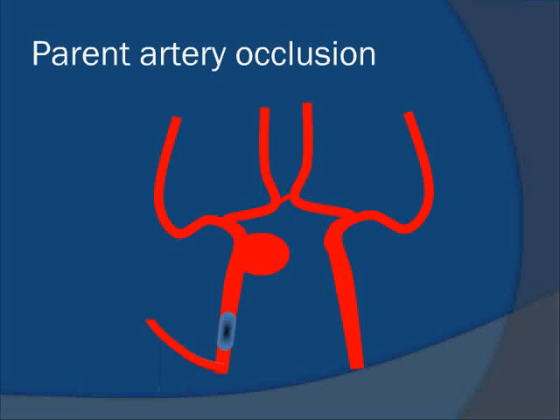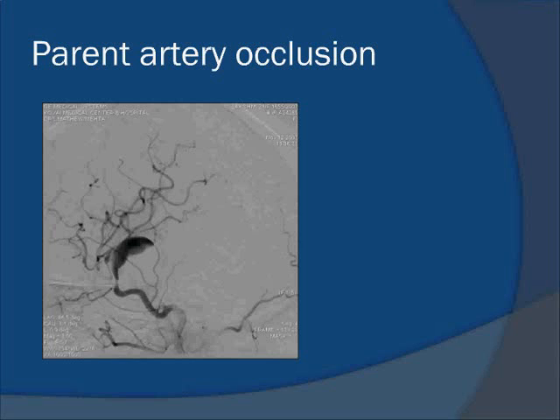So we go ahead and make it permanent by placing multiple fibered coils, and we have cured the patient of the procedure. Now we have a situation we talked about, when the external carotid will fill the aneurysm even after test occlusion. Have a look at this aneurysm. It's a partially thrombosed cavernous segment aneurysm, or a little higher. Actually it will be more like a supraophthalmic aneurysm.